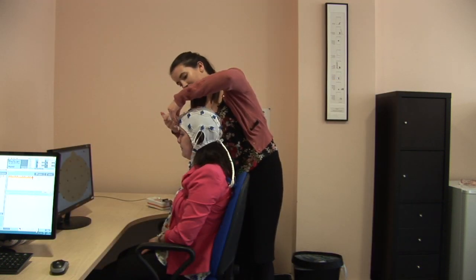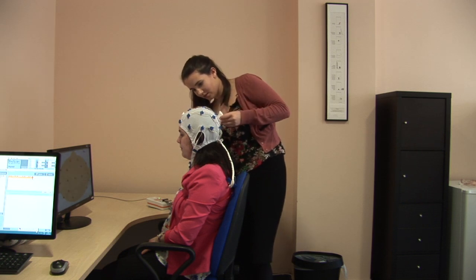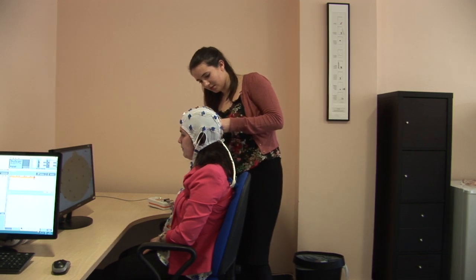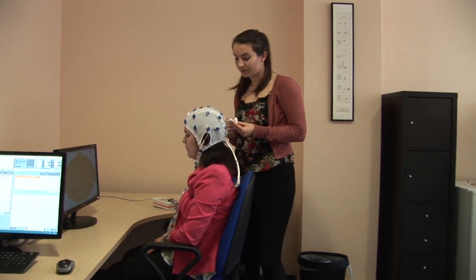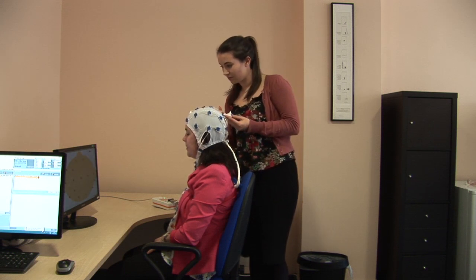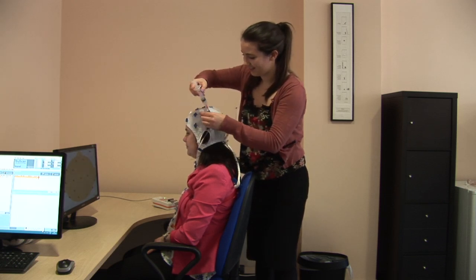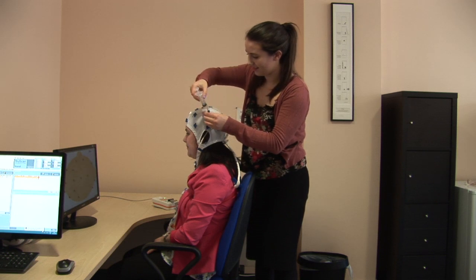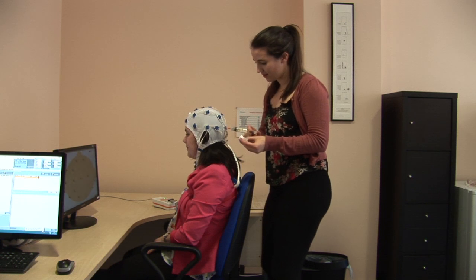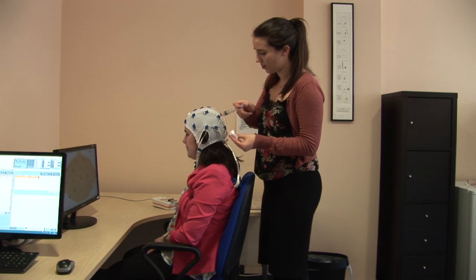Once we have those values nice and low and the cap is in the right place and you feel comfortable, then we're ready to begin to collect our baselines. A standard way of collecting the baselines then is to measure 5 minutes of data with your eyes closed, and then another 5 minutes of data with your eyes open. Now, of course, when your eyes are open you can blink as normal, but our job is to aim to get you as nice, still and relaxed as possible. And once we have our 10 minutes of data and you have completed the initial consultation interview, your initial consultation is over.